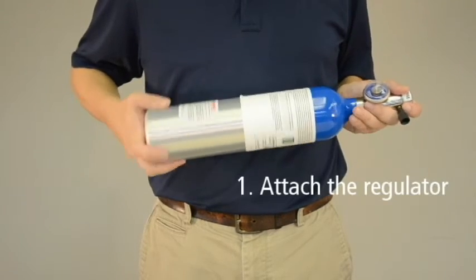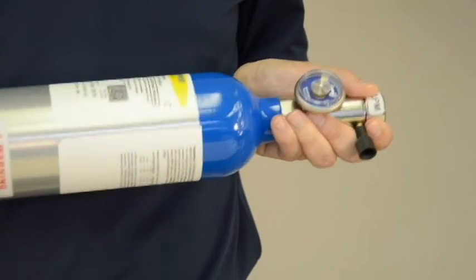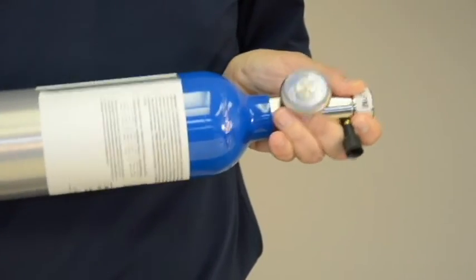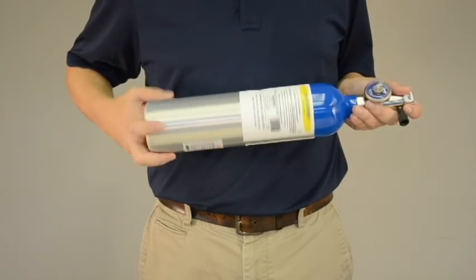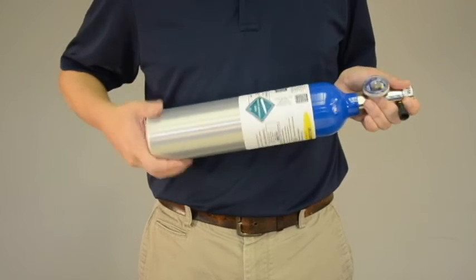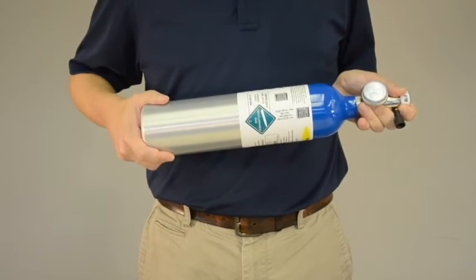First, attach the regulator to the dry gas tank. For safety purposes, point the regulator end of the canister away from your body and away from others. Twist the regulator securely in place, making sure you don't over-tighten. You may hear a pop or hiss sound as you tighten the regulator — this is normal.